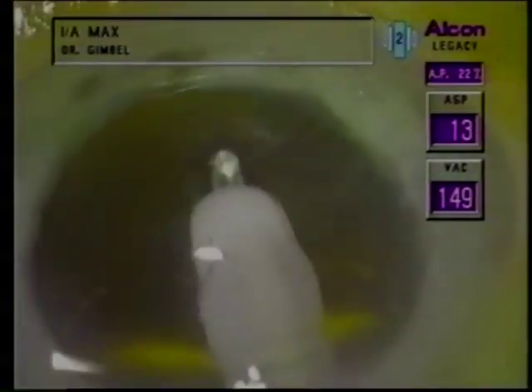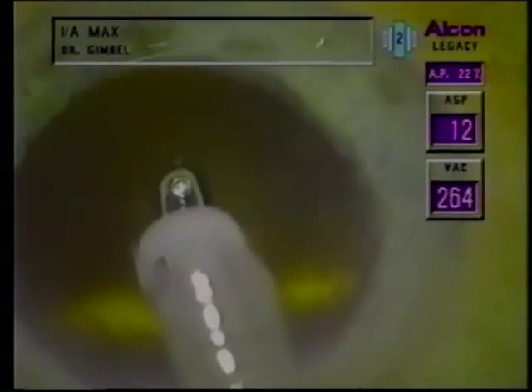With surgeon control of aspiration in IA, I use low aspiration flow rates for working in the fornices to engage the cortex with low vacuum. Once I engage, I pull the cortex out into the safe area and depress the foot pedal to increase the aspiration flow rate. This rapidly increases the vacuum and efficiently draws the material to the port. This is a good example of how one can effectively use independent control of aspiration flow rate and vacuum. Prior to using the Series 20,000 Legacy I was switching between three memories for low, medium, and high-end control. With the Legacy, surgeon control of 0 to 60 cc per minute aspiration flow rate allows for infinite control of aspiration and vacuum. If small wisps of cortex remain, I will polish the capsule with the back of the IA tip, with the port turned up to engage the cortex and strip it with lower aspiration and vacuum.